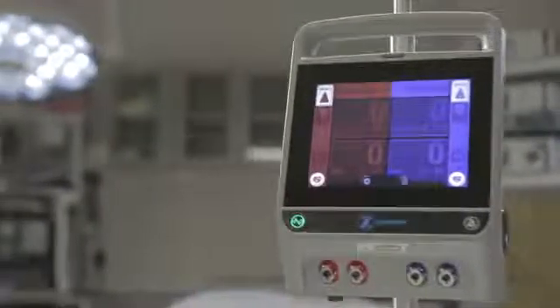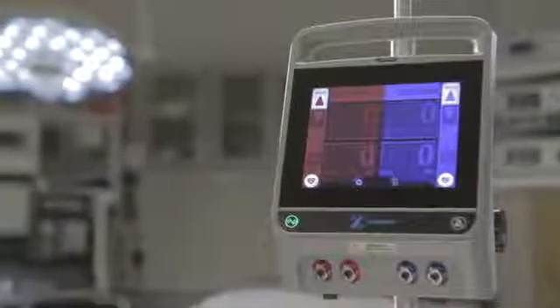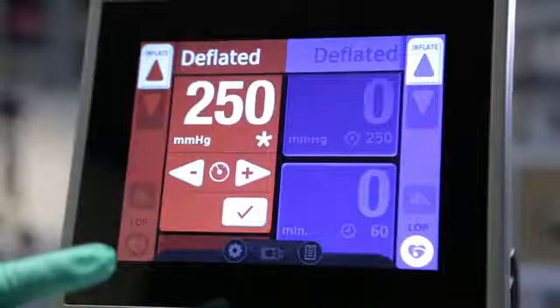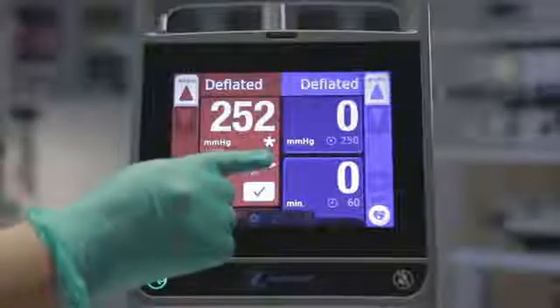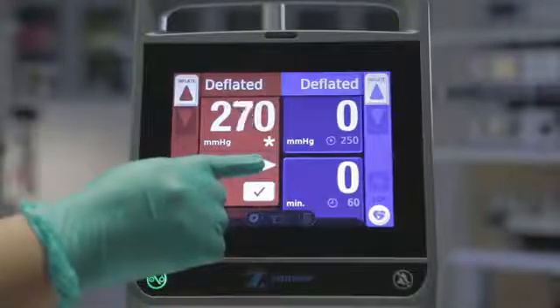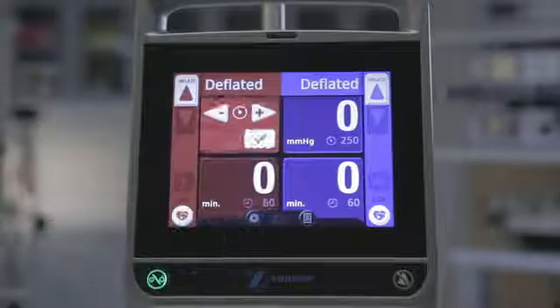The default pressure and time settings are held in the machine's memory and will return whenever the machine is powered up. Tap the pressure tile to display the set pressure. A new tile appears with a pressure display and arrows showing the current default setting. The pressure settings range from 50 to 600 mmHg. Tap the arrows to change in increments of 1, or tap and hold to change in increments of 5. Tap OK to confirm the setting.